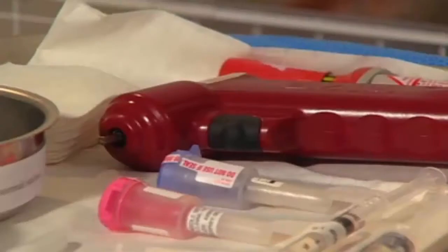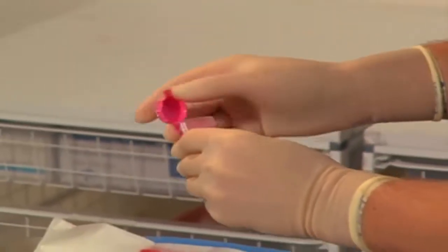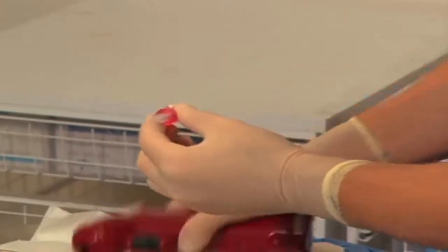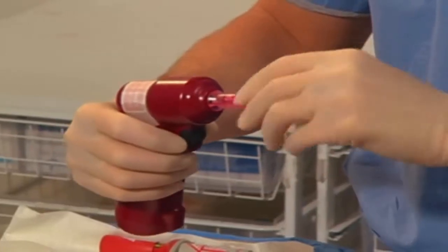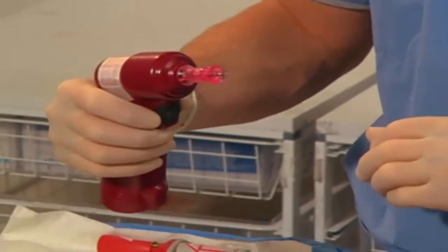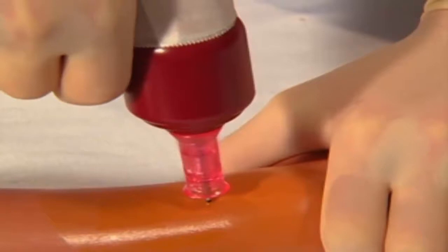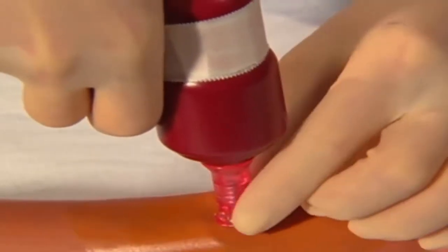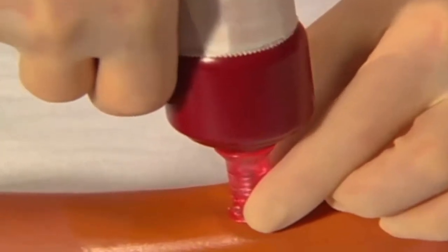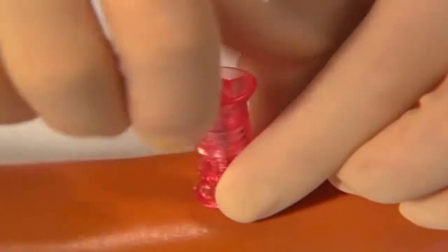For power-assisted insertion, we will demonstrate use of the drill device. Select the appropriate needle size based on the patient's weight; the pediatric needle is designed for children weighing less than 40 kg, unless large amounts of overlying soft tissue predict the need for a longer needle. Remove the needle from its protective container, attach the needle set to the driver allowing the magnetic pull to hold it in place, and turn the safety cap clockwise to remove it. Place the needle against the skin overlying the site, one to two centimeters from the adjacent physis. Apply gentle, steady pressure while engaging the trigger to allow the needle to penetrate the soft tissue and then the bony cortex. Once resistance decreases, marking entrance into the medullary cavity, release the trigger and allow the driver to stop spinning before pulling back or disconnecting. Gently hold the needle, pull the drill directly backward to disconnect, then turn the stylet counter-clockwise to unscrew and remove it.